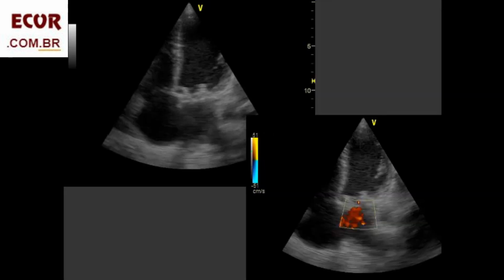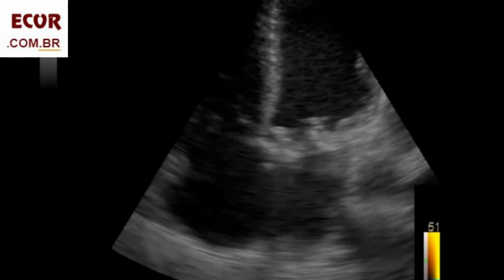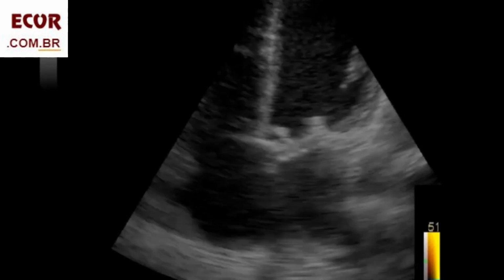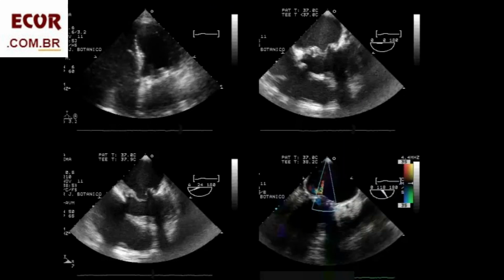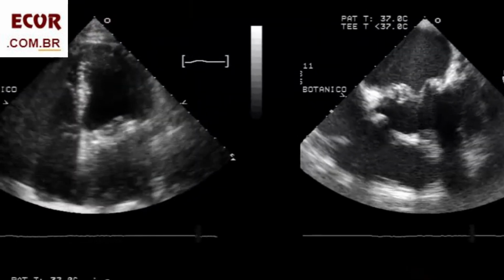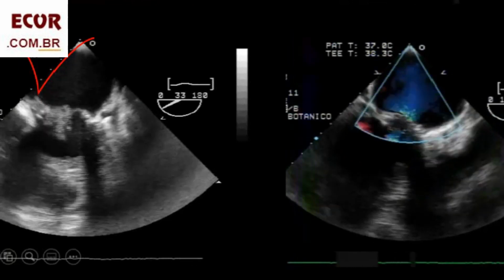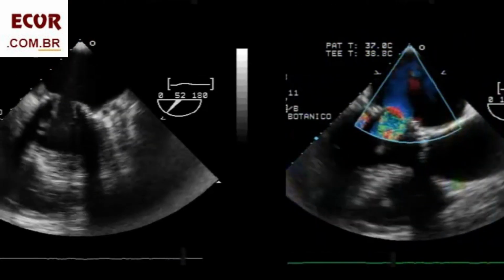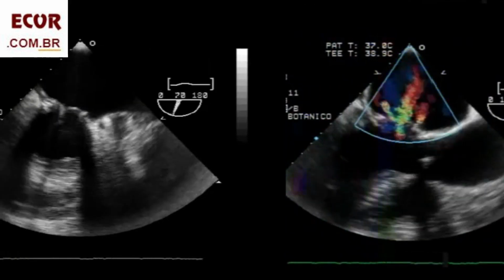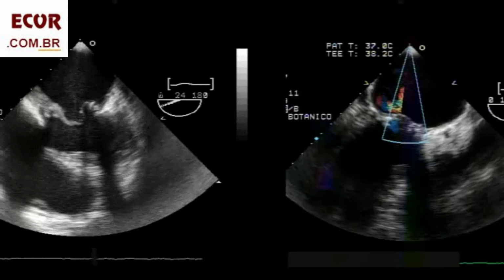Apical four-chamber of a bioprosthetic mitral valve with restriction of leaflet motility, with appearance of pannus, produced an important mitral regurgitation. This is another patient. For certain, it is not a pannus. It has features of a thrombus. See that it is also in the left atrial wall, beyond the sewing ring, and features of endocarditis, including the small paravalvular regurgitation. Help from the clinical status of the patient. This was endocarditis.